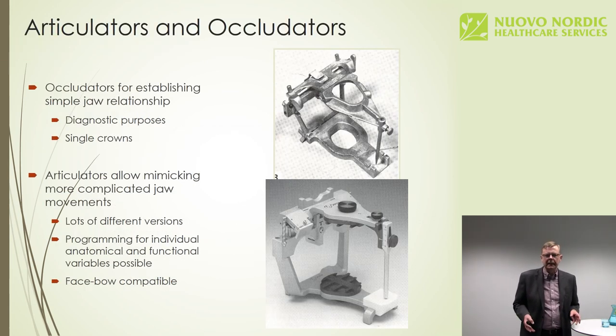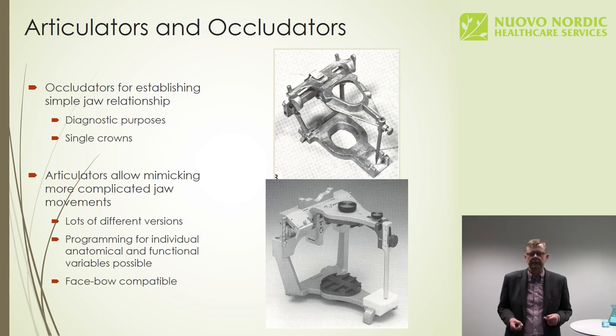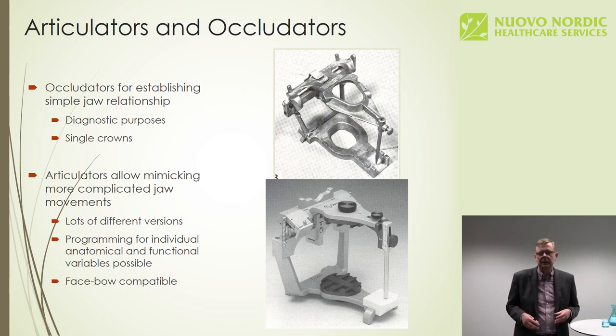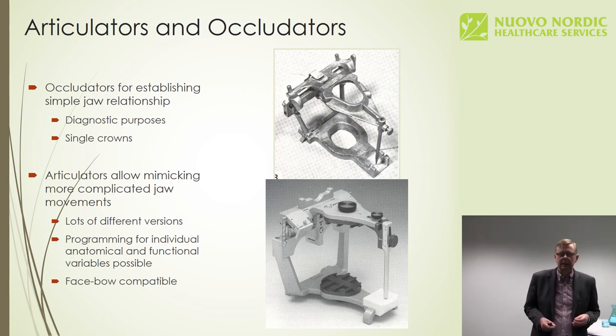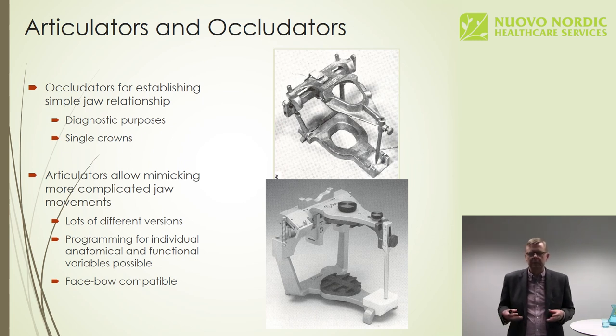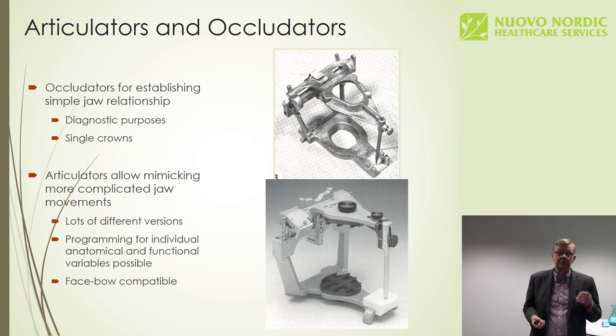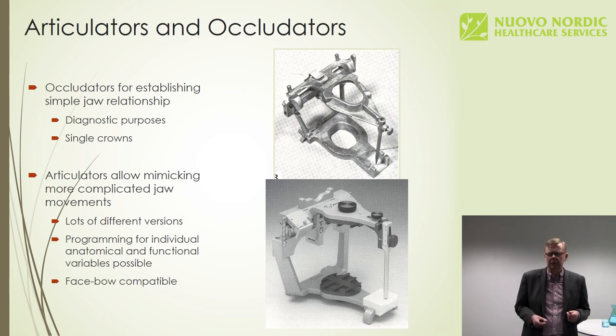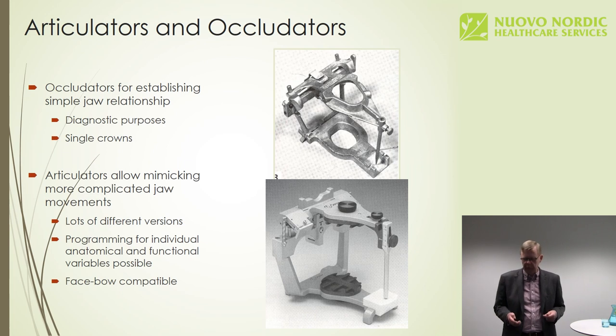The articulators, they are many. In lots of countries in North America where I worked something like 6 years, they had lots of different kinds of articulators, from semi-adjustable to completely adjustable ones, and lots of dentists had different opinions about the use of them. However, for the simplest mounting of the cast and jaw relation records, we could perhaps even use an occludator, which is the simplest of them all. However, a semi-adjustable articulator perhaps would be the best or the most suitable for your work.